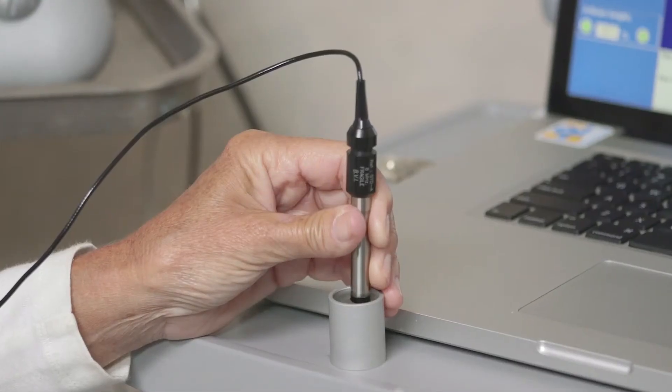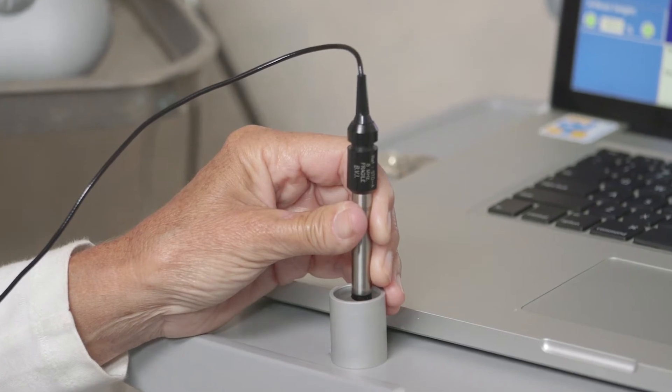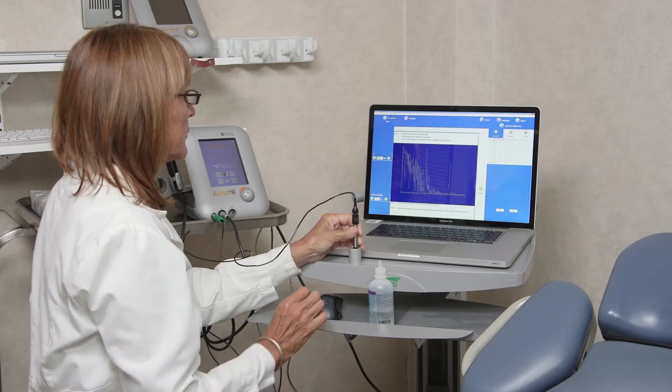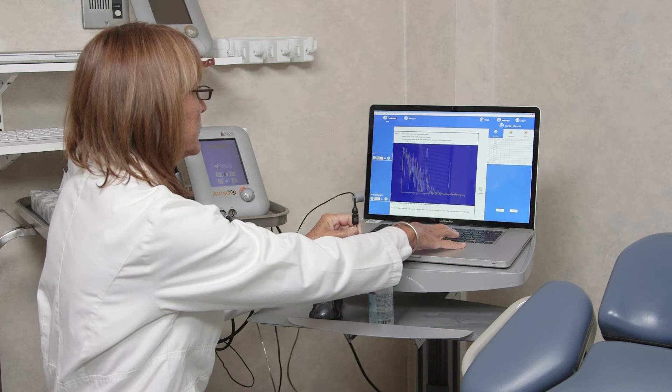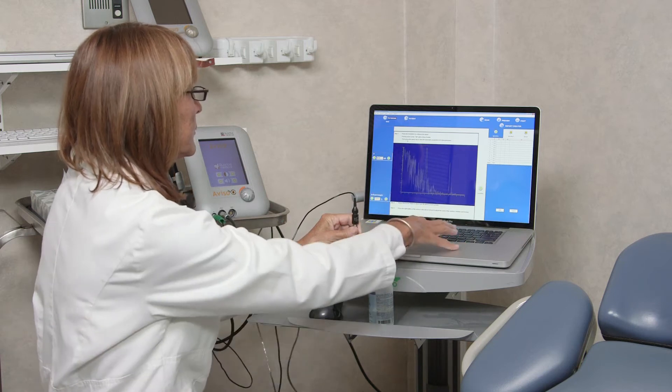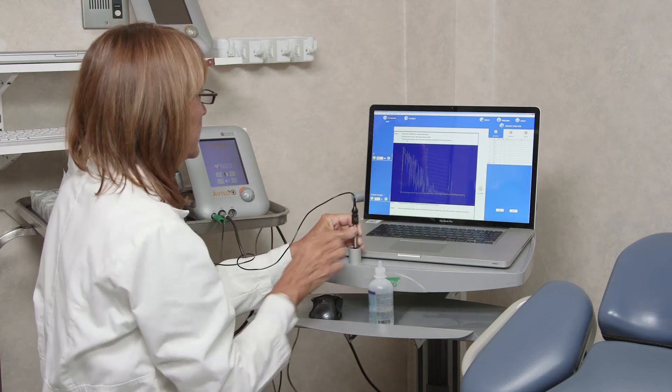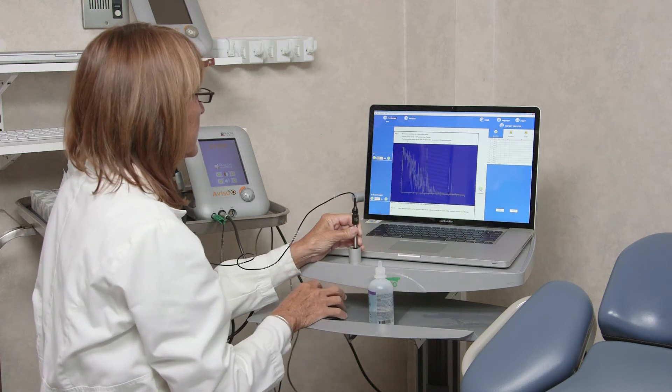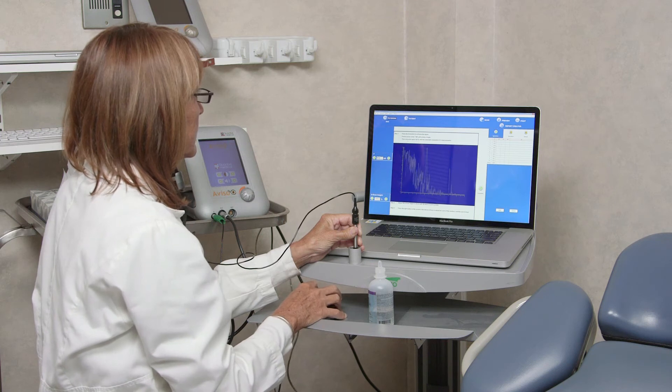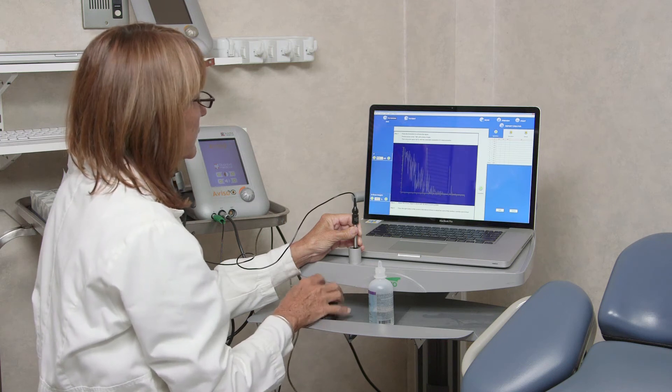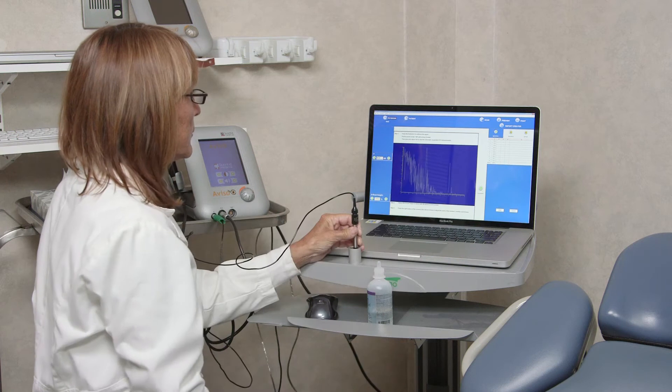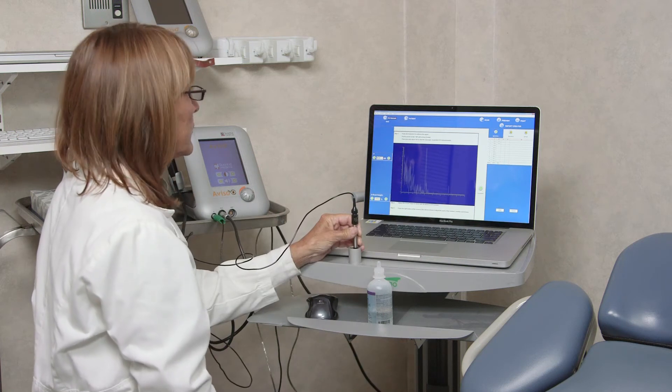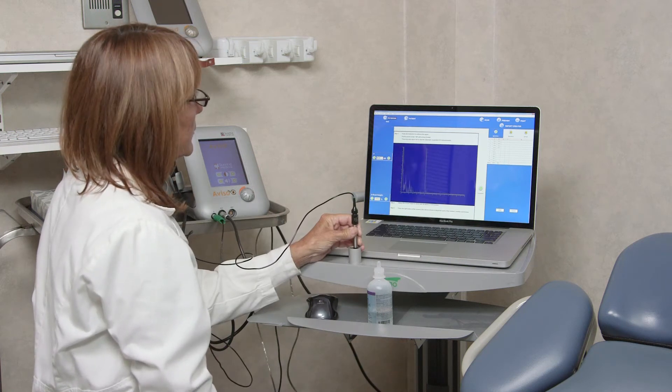Tissue sensitivity can be established for a given machine and probe, either by the manufacturer or by a trained echographer, using a tissue model. Once set, tissue sensitivity should remain constant for the instrument and probe and checked periodically for stability and recalibration if necessary. Quantel's Aviso-S ultrasound platform comes with a tissue model for calibration.